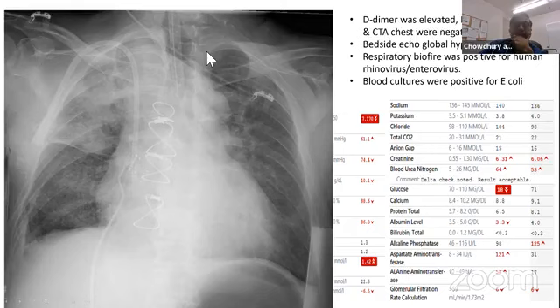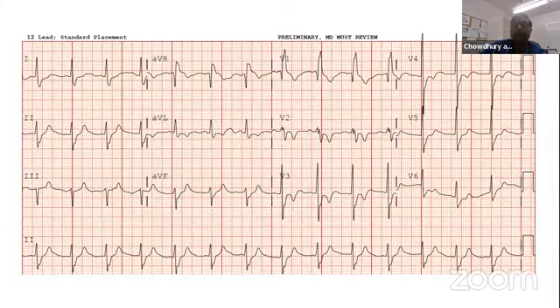So it is important to give a differential because, you know, in the COVID time, we realized that hypoxia, acidosis, aVR ST elevation may look like a left main or multivessel disease, but it may not be. Just metabolic abnormality can give you that. And then we did not take him to the cath lab, everything corrected.